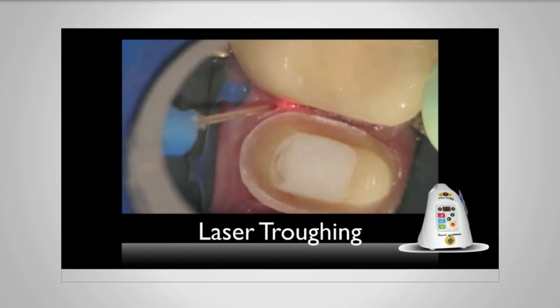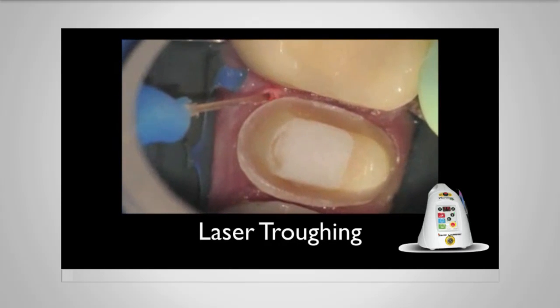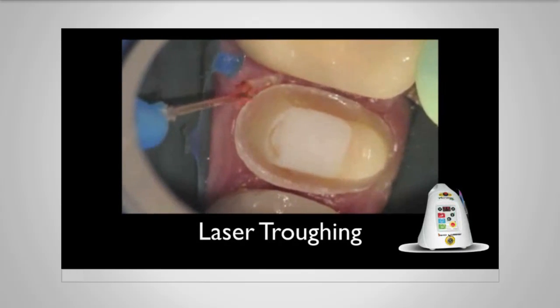Now, in my opinion, as I mentioned, the next best thing is really laser troughing. Is really the next best thing to do. And in some cases, this might be your favorite one. I have no issues or problems with this at all. Lasers can work very well, and they're relatively fast.